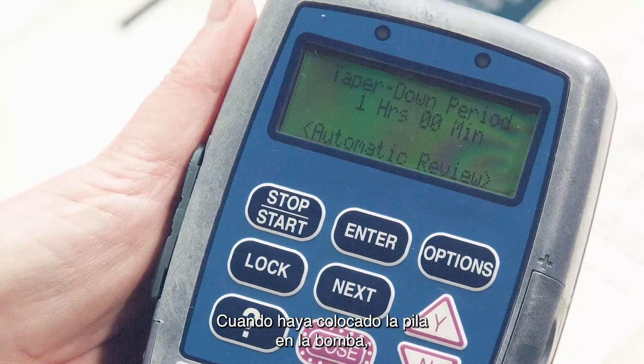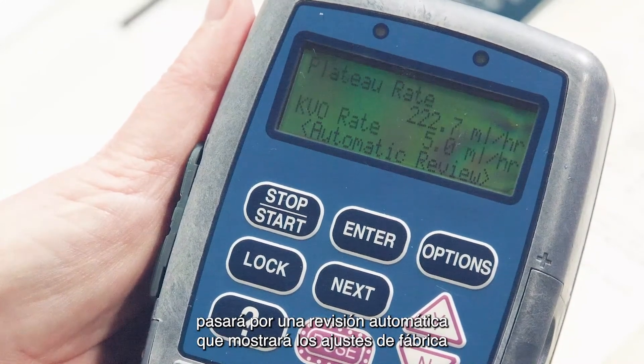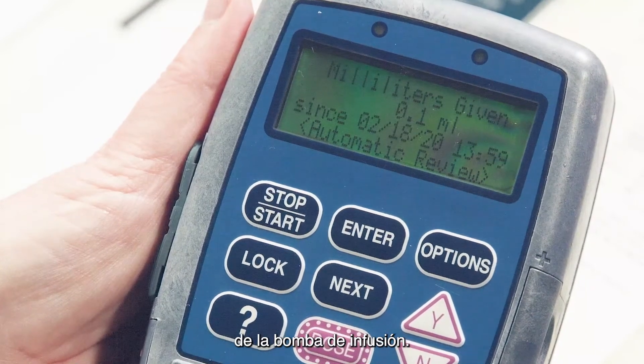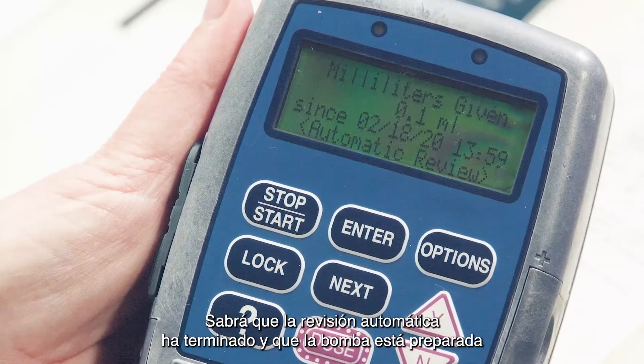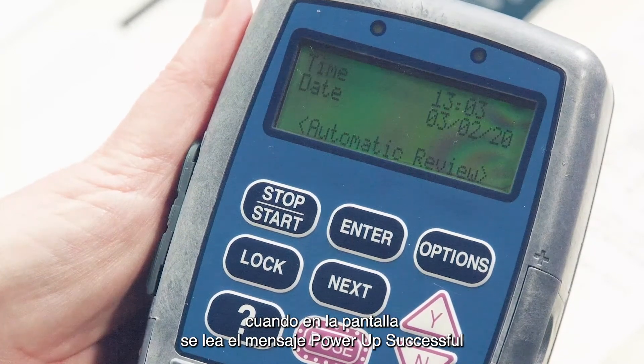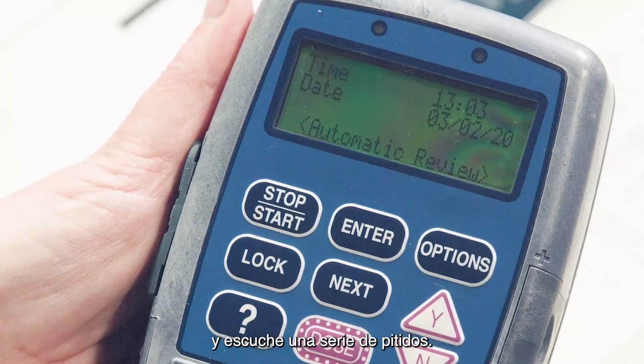Once the battery has been placed into the pump, it will go through an automatic review displaying the pre-programmed pump infusion settings. You will know the automatic review is complete and the pump is ready to be used when the screen reads "Power Up Successful" and you hear a series of beeps.